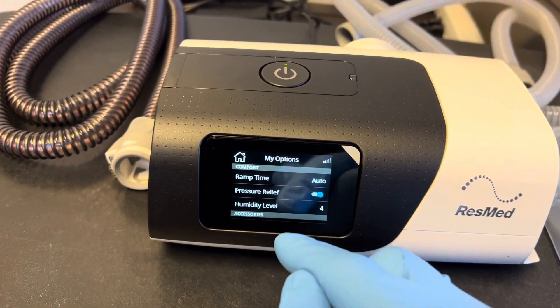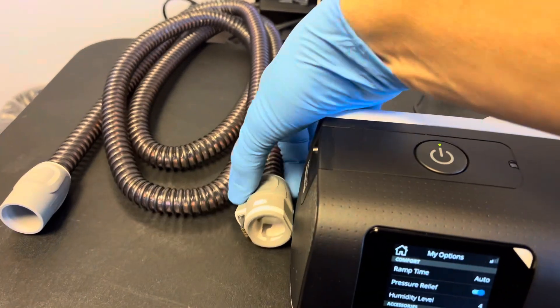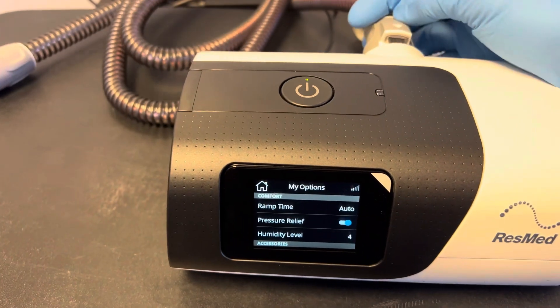If you're using a heated tube hose such as this one that plugs into the back of the machine, we'll have to plug it in to be able to see the other option for the menu.